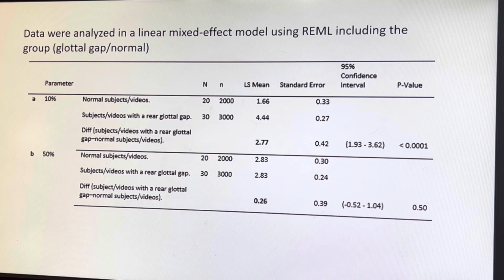The mixed linear model was used because it is an extension of simple linear models to allow for both fixed and random effects, particularly used when there is a non-independence of the data. The SAS statistics show a difference between the 10% lines measured in pixels.